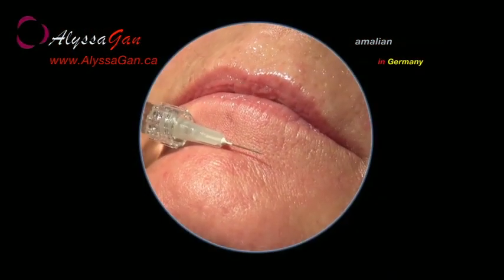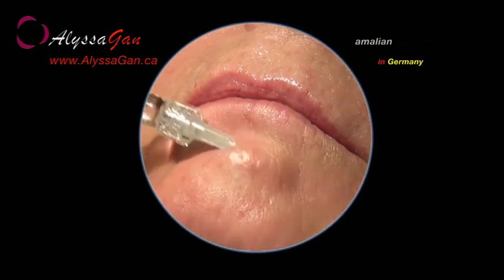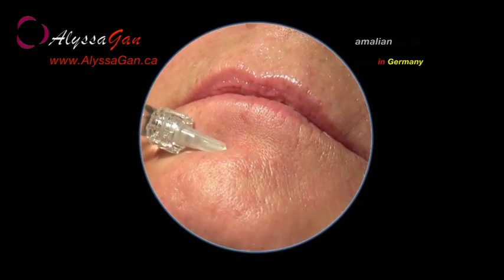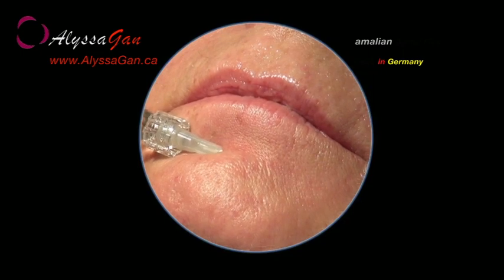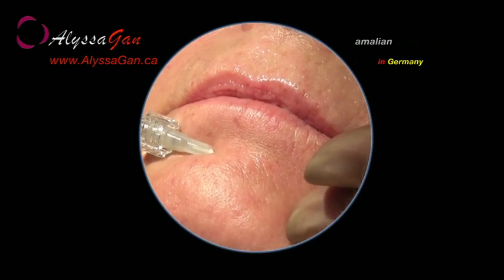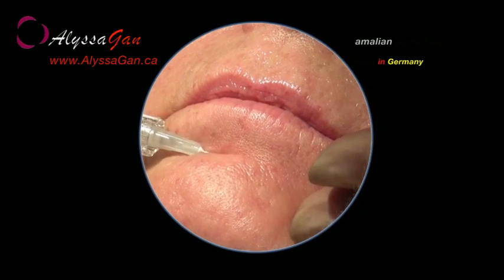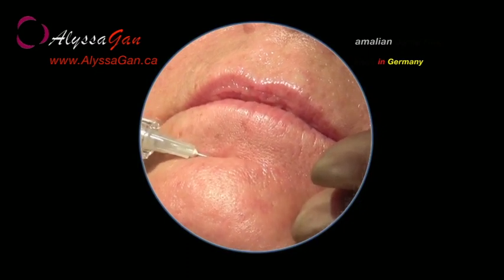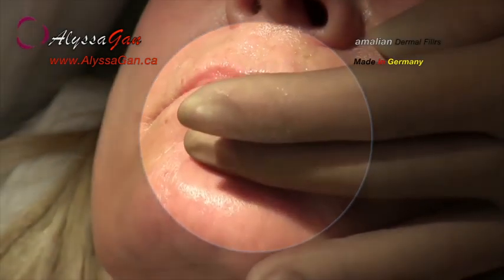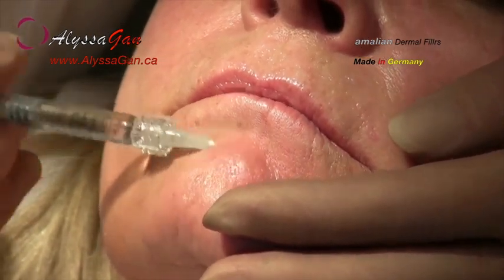In the beginning of treatment, punctual injection is used. A relatively deep and very slow injection is required. The position of the needle tip is carefully controlled in doing so. Slow injection is extremely important in this sensitive area of the face. The physician follows the wrinkle line, applying punctual injection.